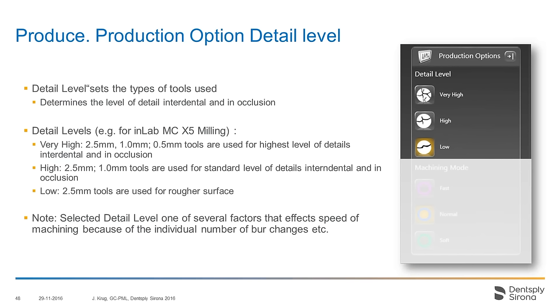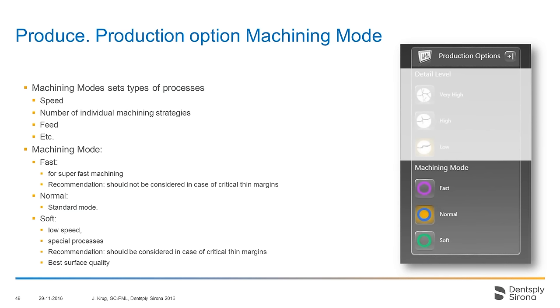Looking at the detail level: with CAM 16, the detail level always determines what kind of instruments will be used for milling the restoration. For example, if you choose Very High, all three instruments for milling will be used. If you choose High, only the 2.5 mm and 1 mm tools will be used. If you select Low, only the 2.5 mm instrument will be used. Of course, depending on which detail level you choose, it will affect the manufacturing time, and what machining mode you choose will also add milling time accordingly.